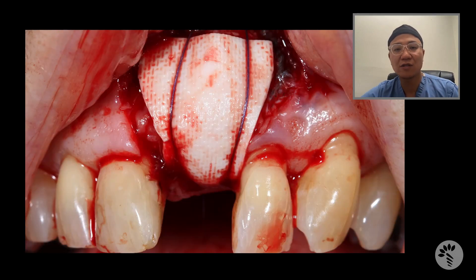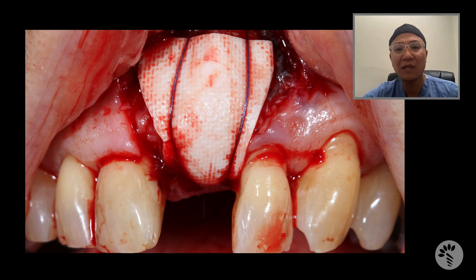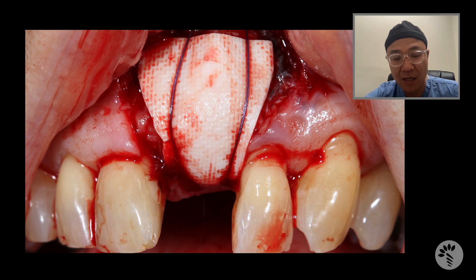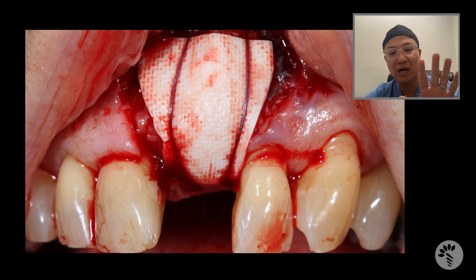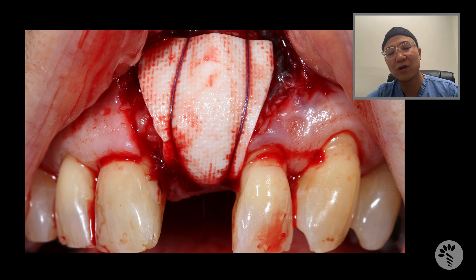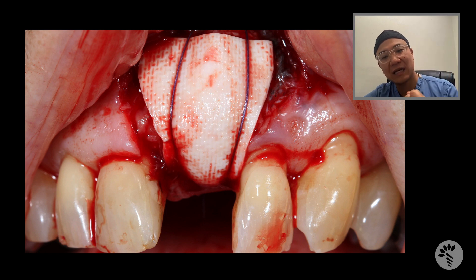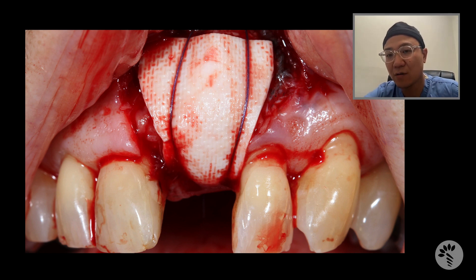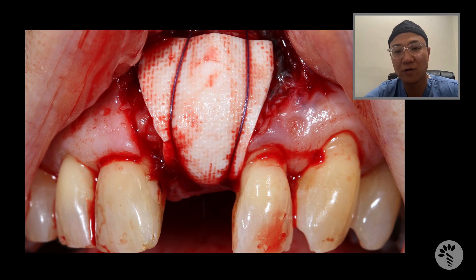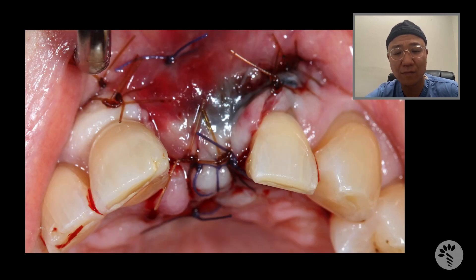After that, I used a cross-linked resorbable collagen membrane, which is completely tacked using a periosteal suture technique. The membrane is completely immobilized, and this membrane will be there for about six months. I then advanced the flap coronally to close this area completely by achieving primary closure.